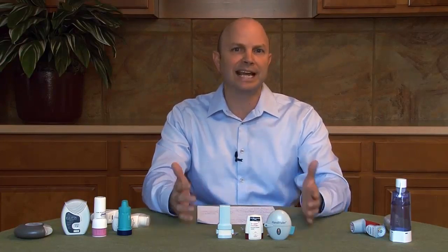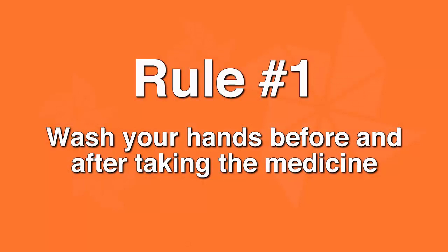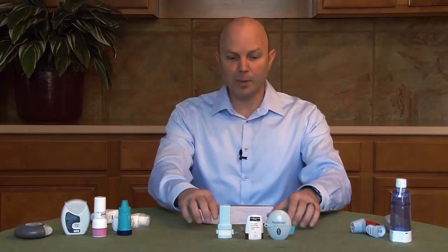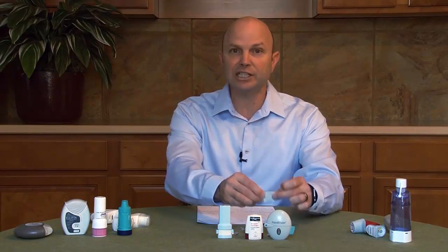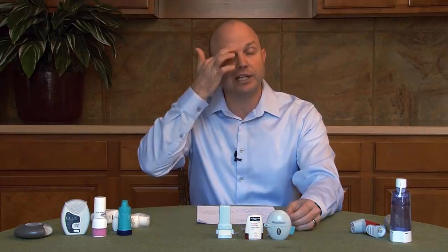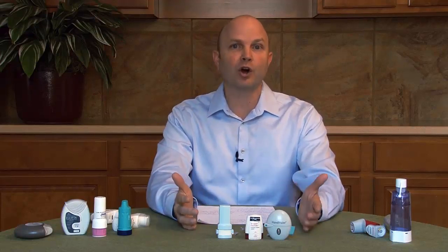There's a couple general rules that I think you should follow that'll make it very easy for you to remember and to take these medicines. General rule number 1, it's a good idea to always wash your hands before you take the medicines and then again at the end of taking the medicines. The one where it matters most is when you use these capsules, where touching the medicine might cause a skin irritation or an irritation of the eye that will cause your pupils to become dilated.